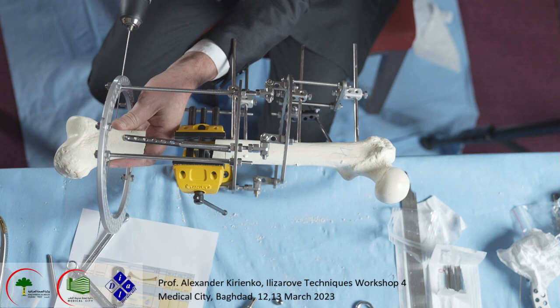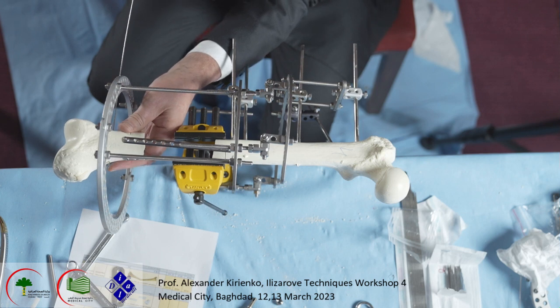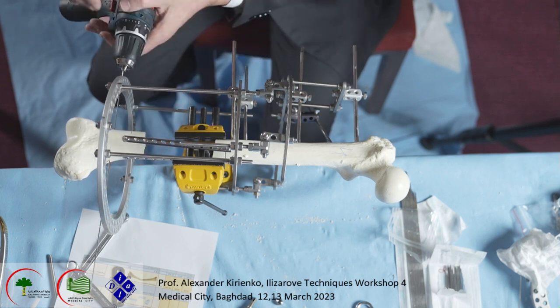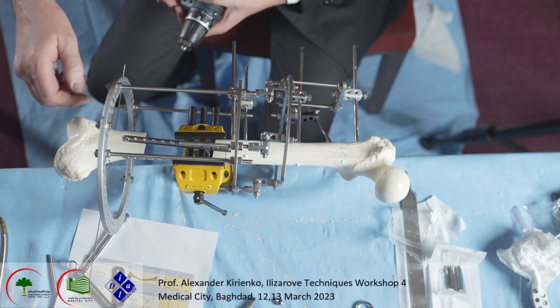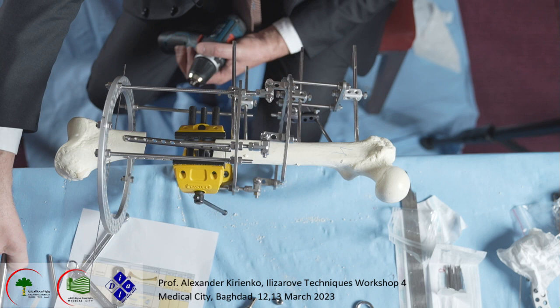You may flex the knee of the patient, and after that, introduce the wire again. If it is not good from the lateral side, what you may do? You may cut the wire here, cut it obliquely, and do the same job here.